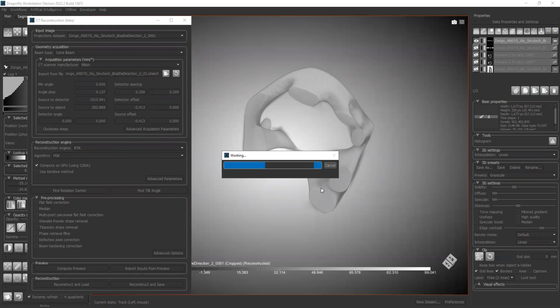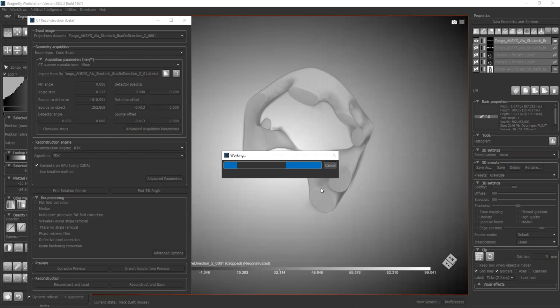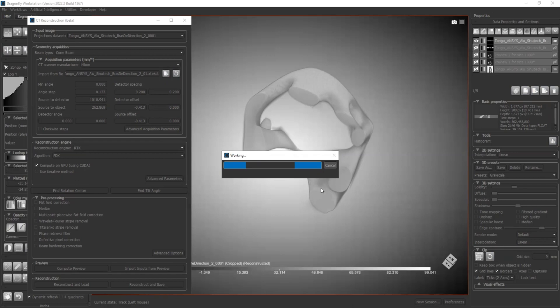So what this reconstruction and save option does is it's going to split your full dataset into different slabs according to the memory limits your machine has, and then it's going to reconstruct one slab by slab. Once each of the slabs is reconstructed, the reconstructed volume will be output in the format of multiple TIFF files - one image for each of the slices. So by the end we should have 2000 TIFF files saved in the folder we just pointed to.